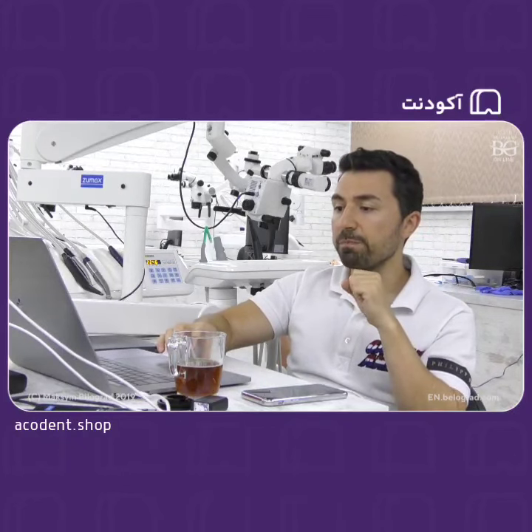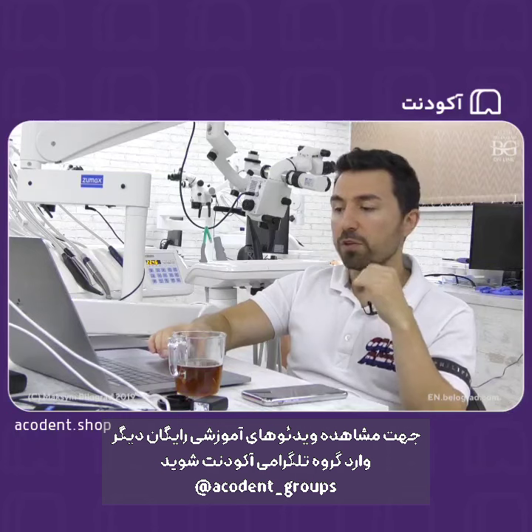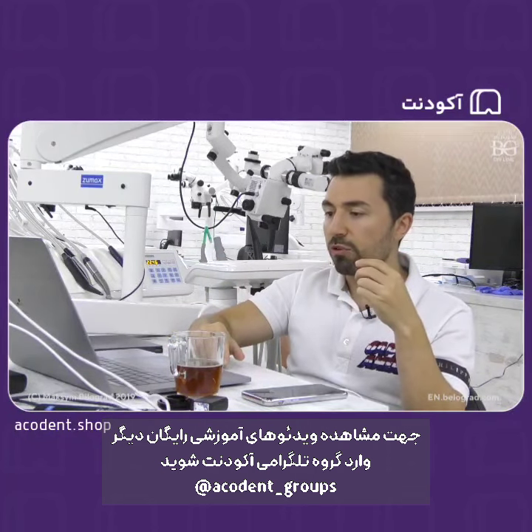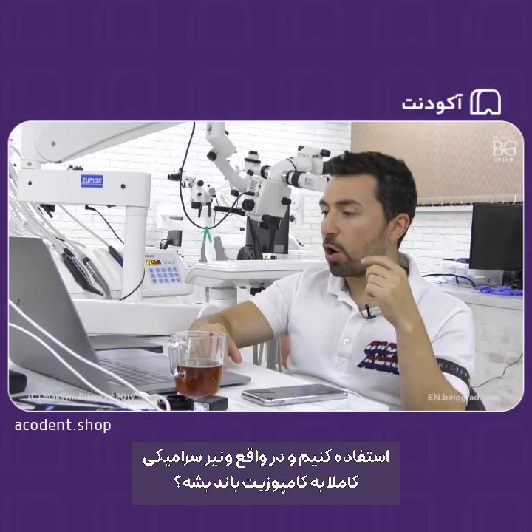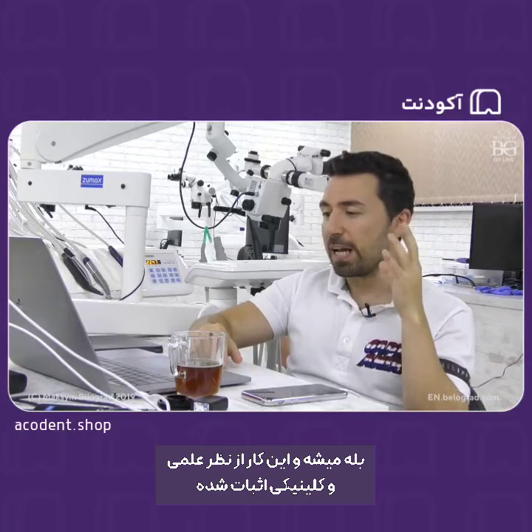This is my answer. Ayman, my question has been skipped. Ayman, sorry for that, so if you will repeat this question now, I will reply to it. Can we do an overlay on composite restoration after root canal treatment, so the ceramic is totally bonded to composite? Yes, we can. And it is now scientifically and clinically proved.